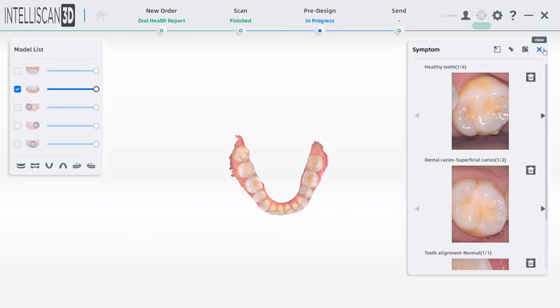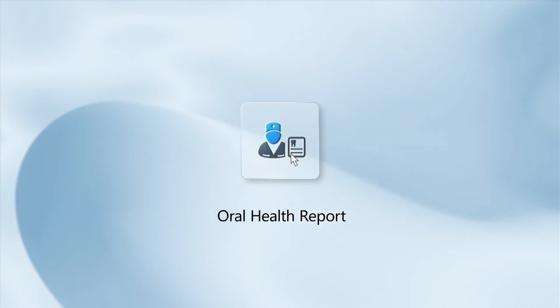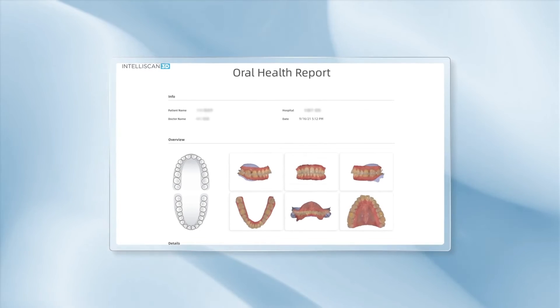Intelliscan Model X will organize your photos and notes and print a report for your patients so that they can walk out with your recommendations in a clear, non-confusing report with photos to motivate your patients to say yes to the best.